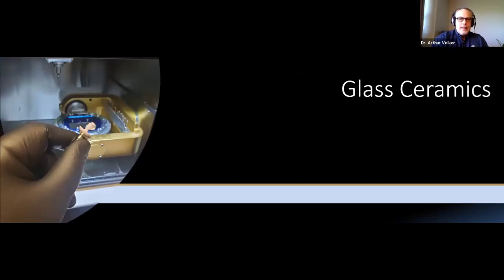Now, when we made glass ceramics, just so you have some idea, maybe to entice some people, the first thing we do, whether we're doing it in press or CAD form, is that we want to make our design.